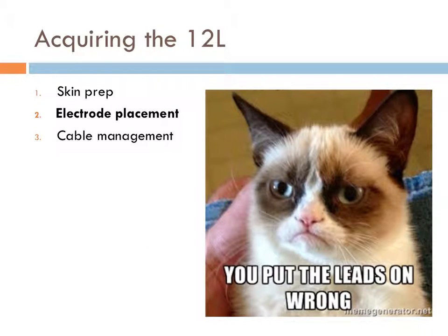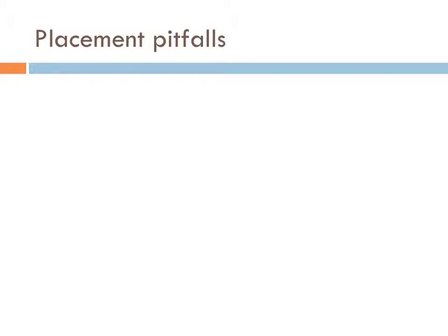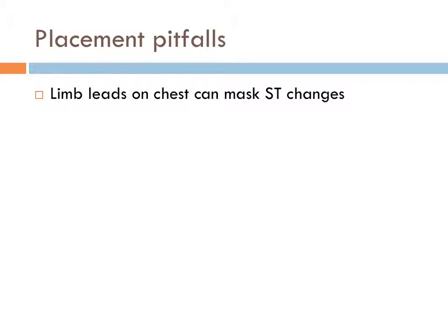Acquiring the 12 lead. Next part, we're going to look at electrode placement. So two big problems that often happen with placement of the electrodes. The first one, putting the limb leads on the chest. So you've probably seen that instead of being out on the arms or legs, they're attached to the chest. That can create or mask ST segment changes, which is a lot of what we're concerned with.